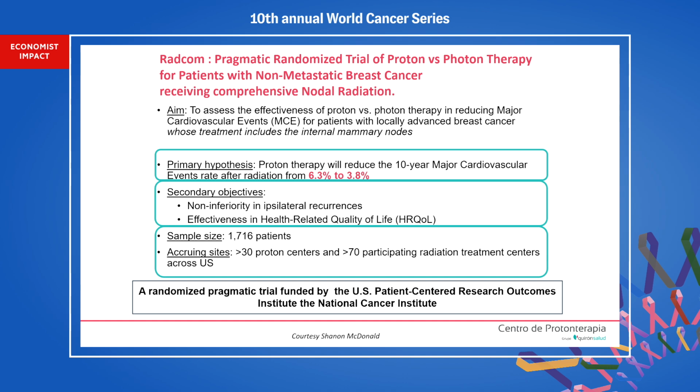The next step will be to integrate the concept of cost effectiveness in the choice of the best treatment for the patient. In the case of head and neck cancer, for example, the choice of proton therapy could be made not only based on the risk of dysphagia, but needs to include other parameters like the patient age or the positivity of HPV inside the tumors, because previous cost effectiveness analyses showed that the patients who benefit most from this type of advanced radiation therapy technique are the patients who are young with HPV positive tumors.